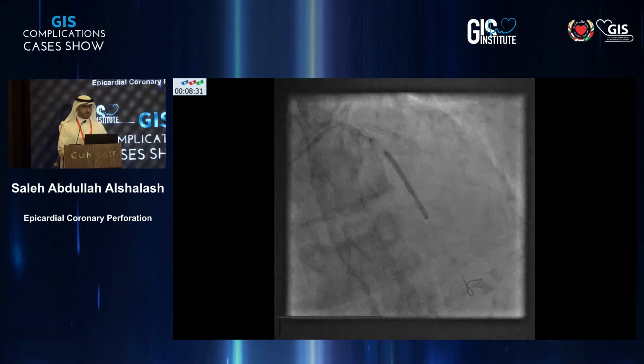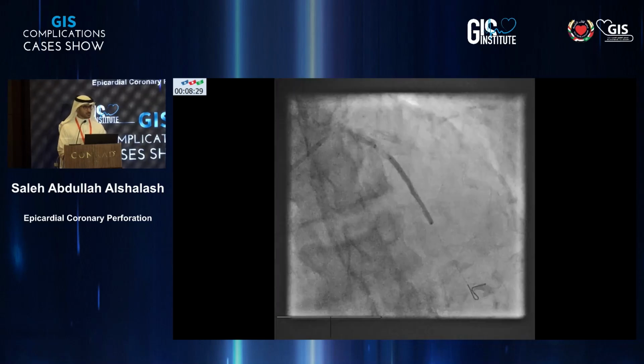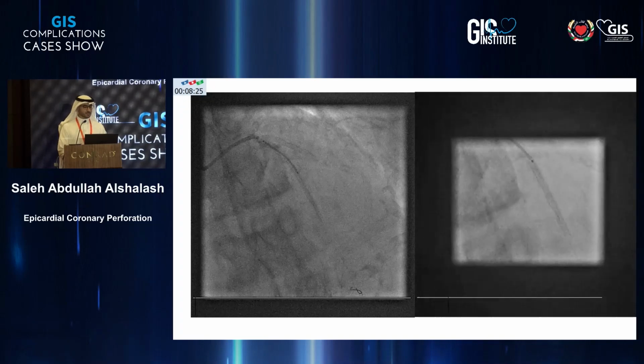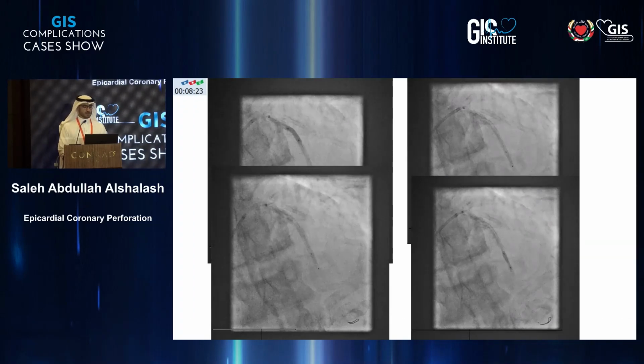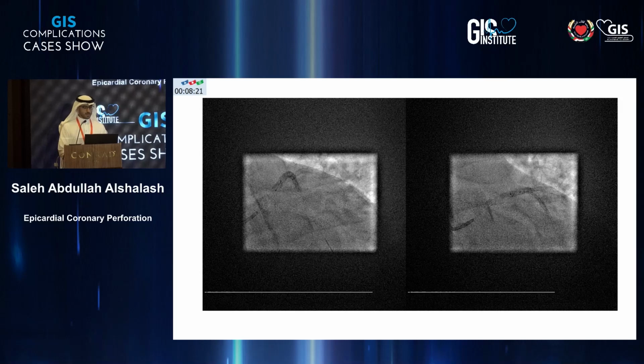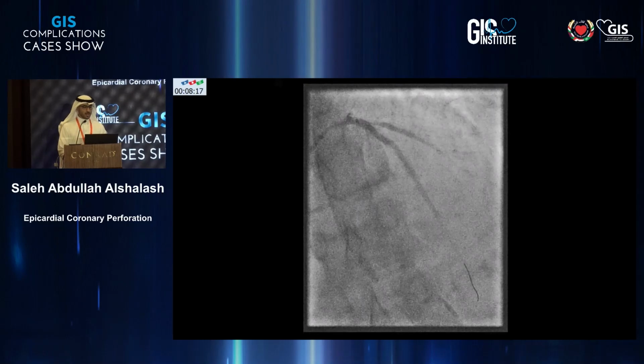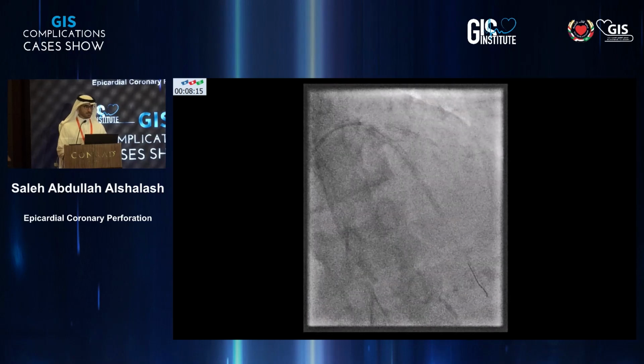We put a long stent, struggled to deliver it, used the guide liner, brought another stent, overlapped it, and so far so good. We're a bit tired, and that's when the trouble started.